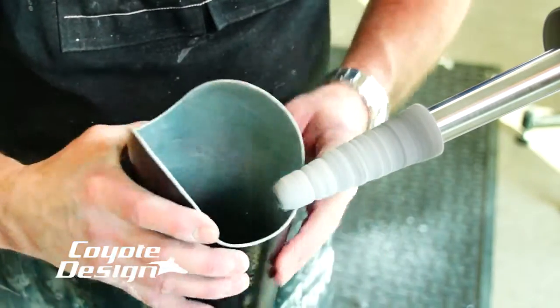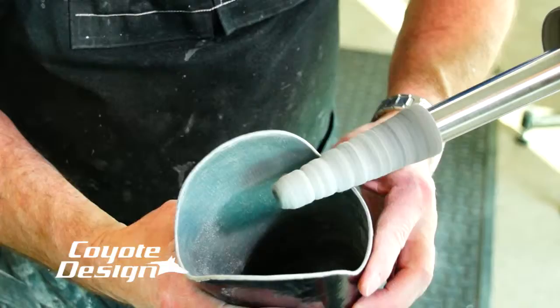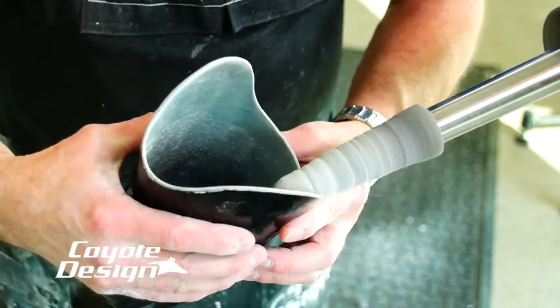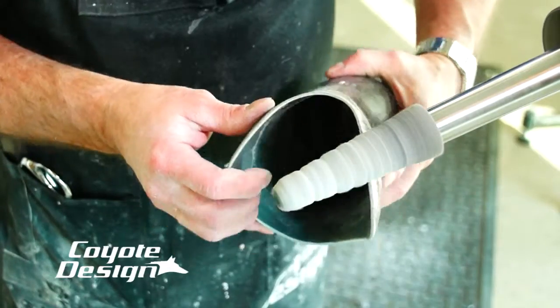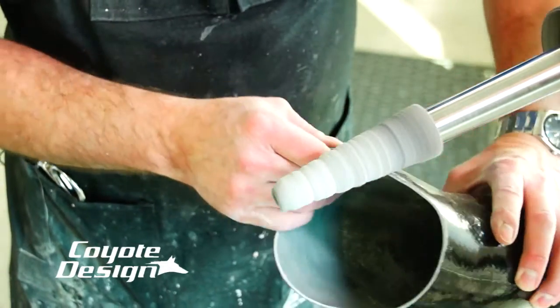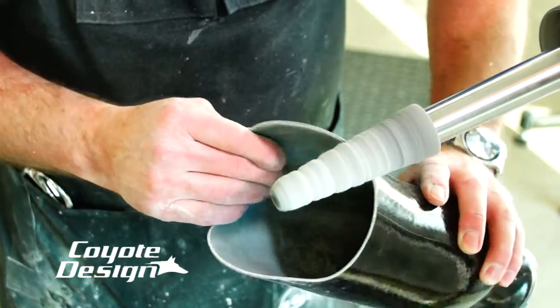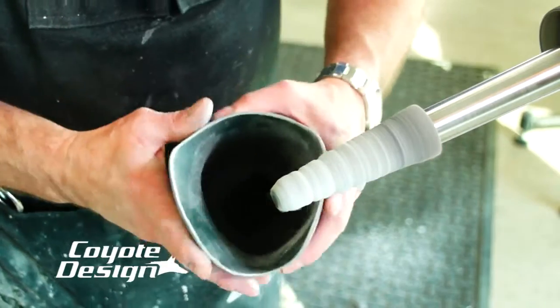Now I'm on slow speed and I just take my time, working the inside and the outside. Don't use a lot of pressure — just make sure you're polishing everything you can. By running it on slow with minimal hand pressure, you can work it back and forth: outside edge, the very top leading edge, the inside edge — without creating sharpness. You're just blunting everything down.